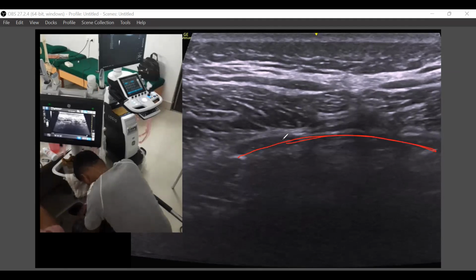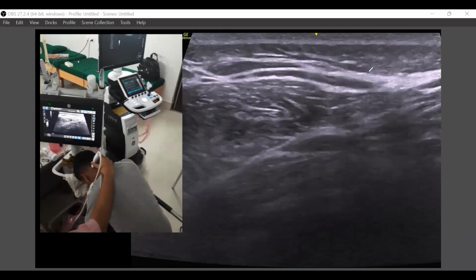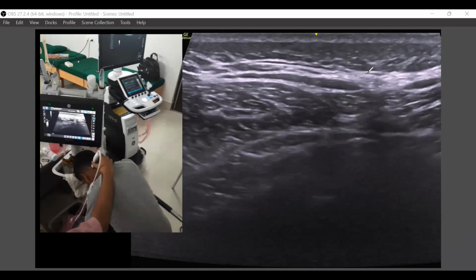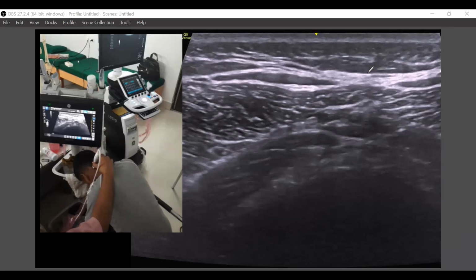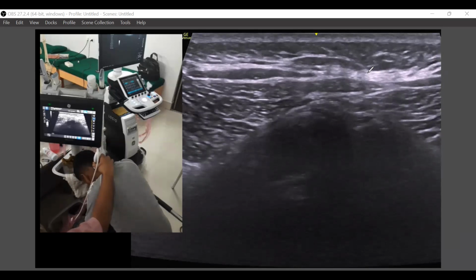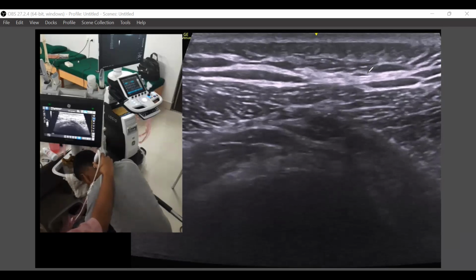I have frozen it a little bit down. Here what is important is we will not be able to see the spinous process, which will be coming down at the C2 level. So if I'm coming down, occiput, then this is C1, and then C2 is coming, and C2 will have the bifid spinous process. So this is your C2. Now if you are looking at the muscles, what can we see here.